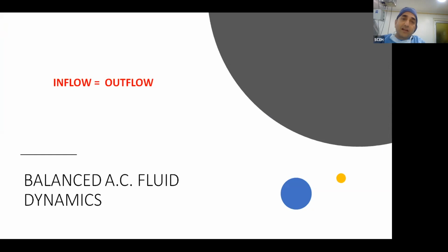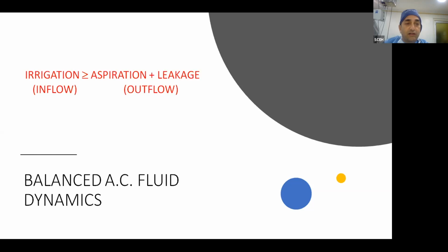Now, we just had a question. How do you balance the anterior chamber fluidics? Intuitively, inflow should be equal to outflow, right? And that's why quite a number of participants said irrigation should be equal to aspiration. However, that's not correct.